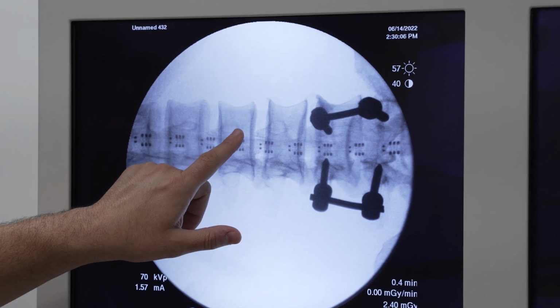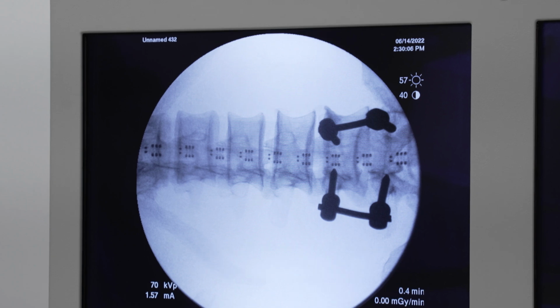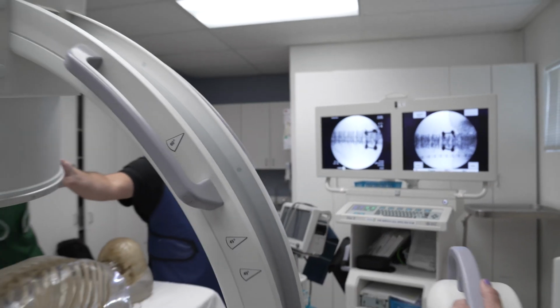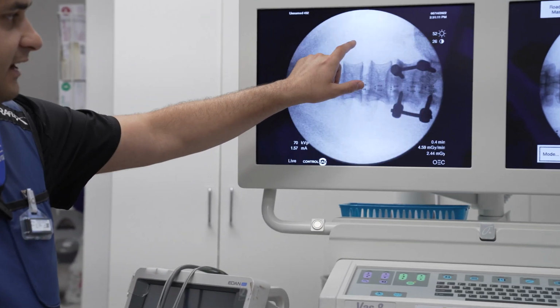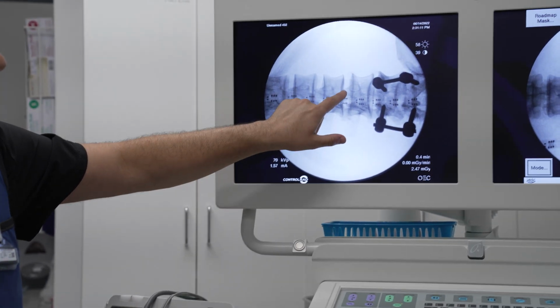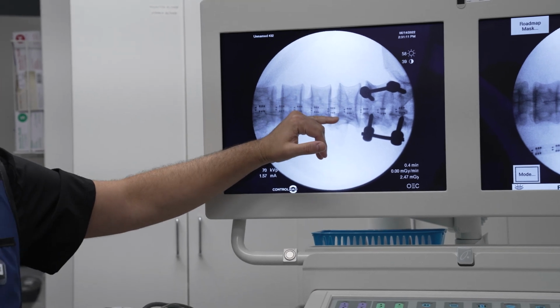So if we tilt to the feet, we're going to bring that pedicle up by tilting to the feet a little bit. So I'm going to tilt to the feet just a little bit. I can push it if it's open. There we go. Good. That's probably enough. And now we brought that pedicle up here, and we're going right for that area right there. You can see the facet joint here. That's now out of our way. That's medial. We're not going to hit that facet joint.